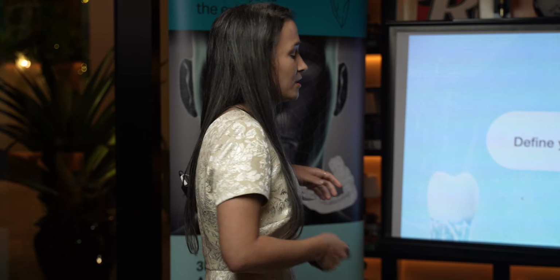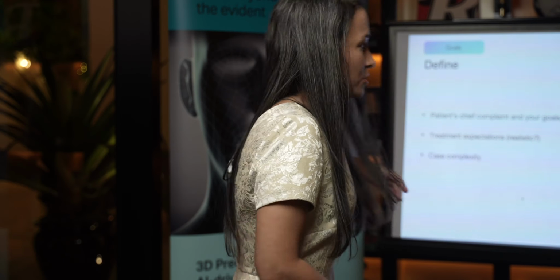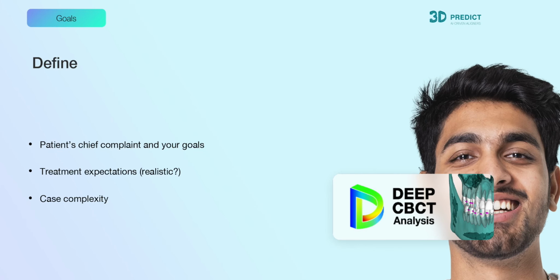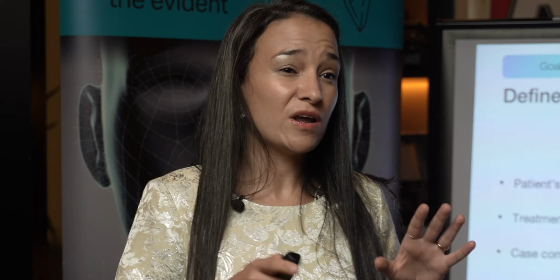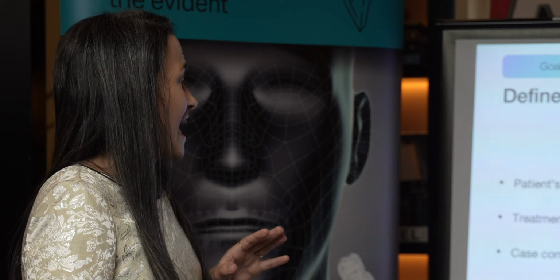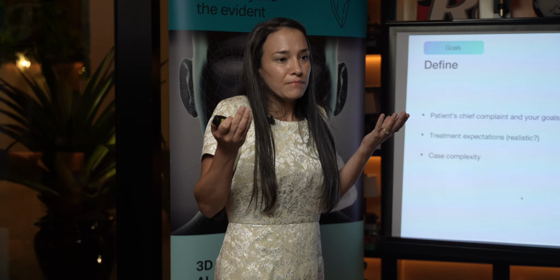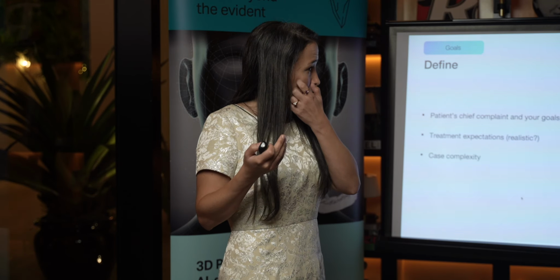So let's talk about defining your clinical goals. We're going to go through, what is the patient's chief complaint? And what are your goals with this patient? You know, I had a call, I think it was like a week and a half ago, with a doctor. And we got to the point that the doctor, because she was moving posterior teeth, right? We had all this treatment plan set up that was outside of predictability limits, and the doctor was frustrated. She hadn't even approved the first treatment plan, by the way. And I actually stopped the call and I said, but doctor, what is the patient's main goal? What is the patient's chief complaint? And that was not on the prescription.